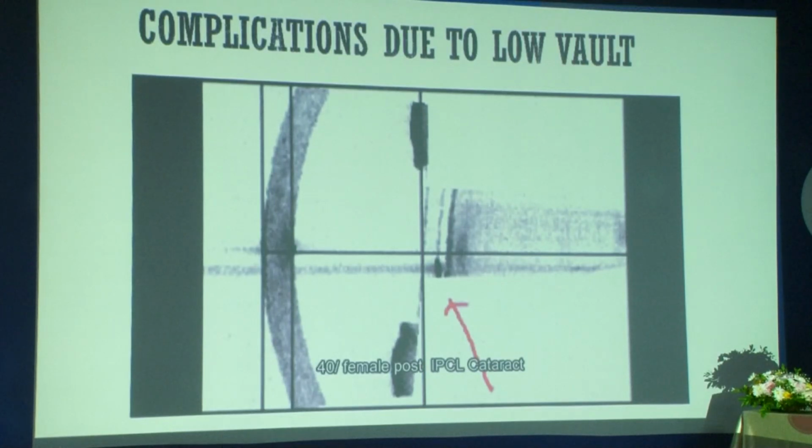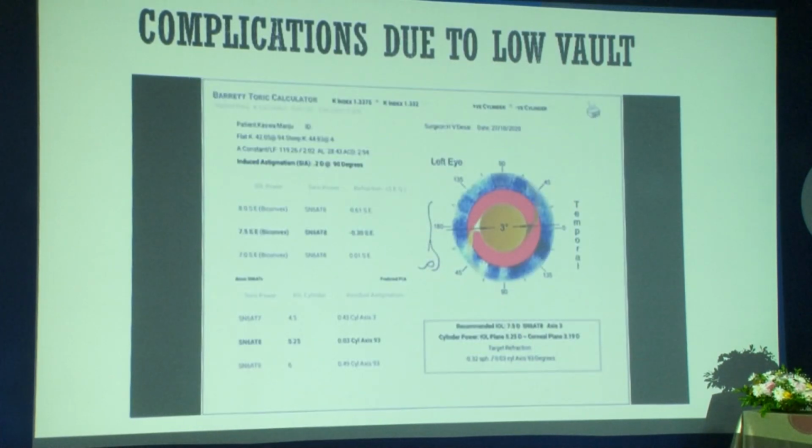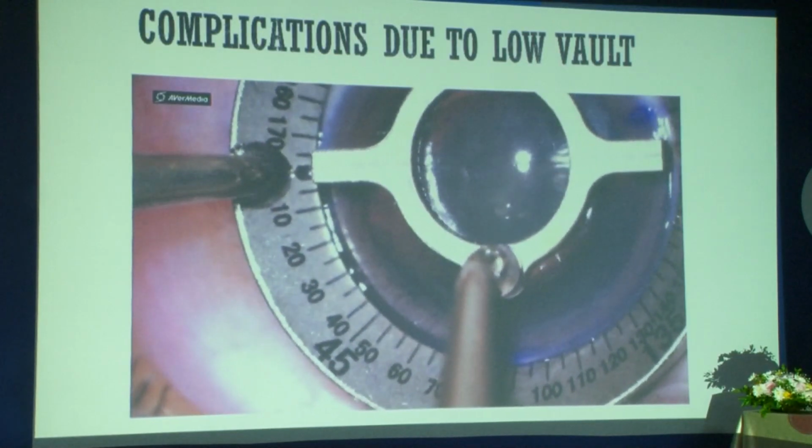So you can see the cataract. Now, this patient presented with a toricity of about 2.78 diopters, and we decided to put a toric IOL in it. That's the surgery. So basically, you do your toric markings, you make your usual wound.